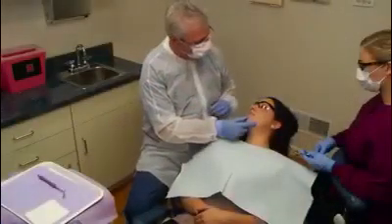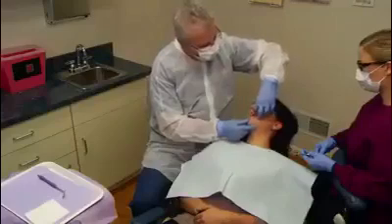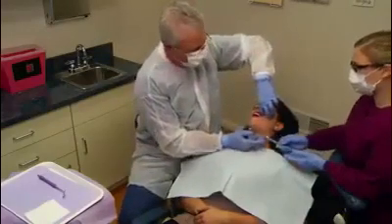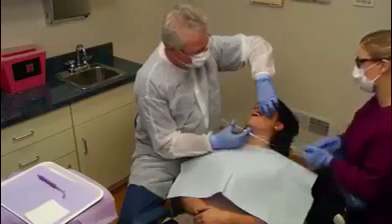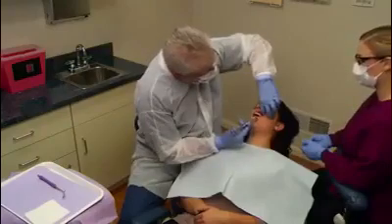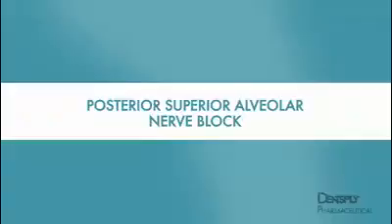For a right-handed operator performing a left infraorbital nerve block, the clinician should sit in the 11 o'clock position, this time with the patient's head turned toward the operator side. The left thumb is used to palpate the infraorbital foramen and the index finger is used to reflect the upper lip. For the left-handed operator, the mirror image of the techniques illustrated in this video may be used. Posterior superior alveolar nerve block.